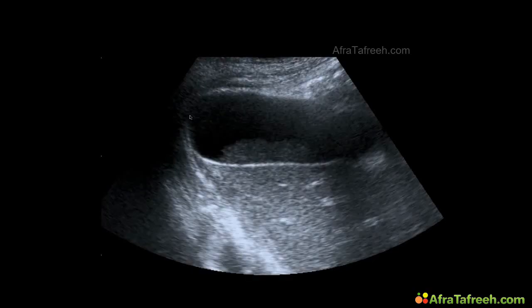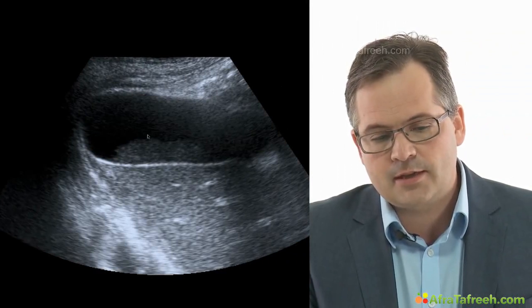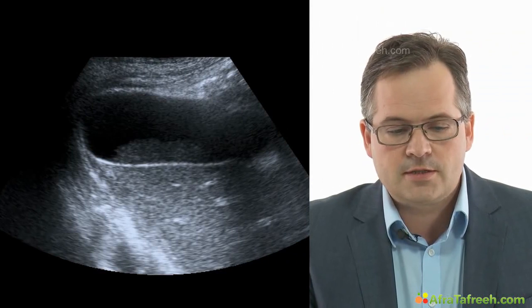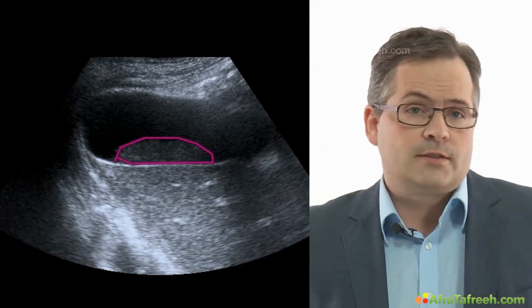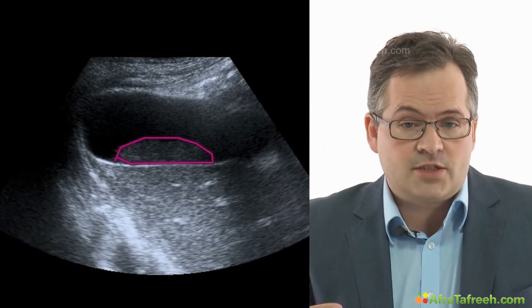How does sludge look? We see it over here in the gallbladder. It's not totally dark, not totally black. There are hypoechoic echoes in this region, marked over here. When bile has been stored in the gallbladder for a longer period of time, it may become thicker and then appear in the form of sludge.